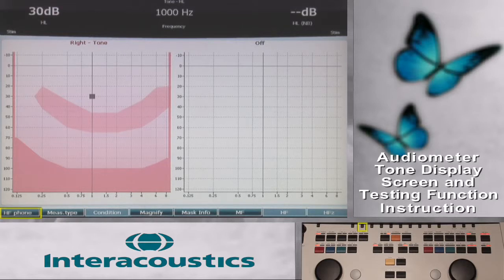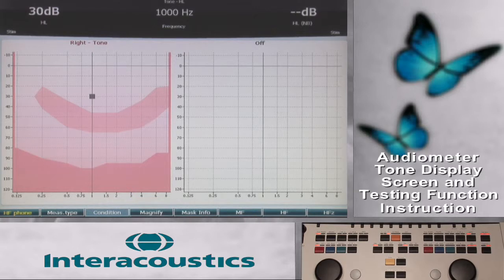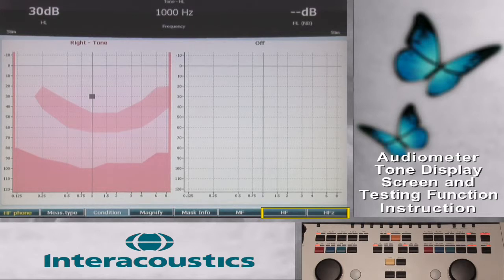When in the Tone screen, the first function key is the HF phone, or high frequency phone. This allows immediate use of the HDA200 phones for high frequency testing. Once the HF phone key is selected, additional function keys become active, which are the HF and HFZ on the right side of the screen.